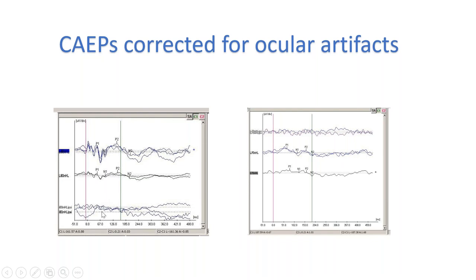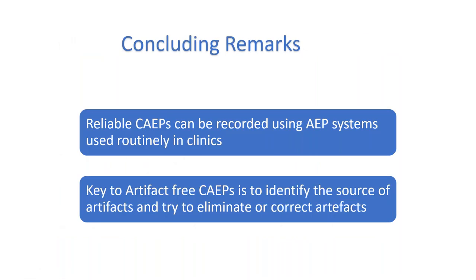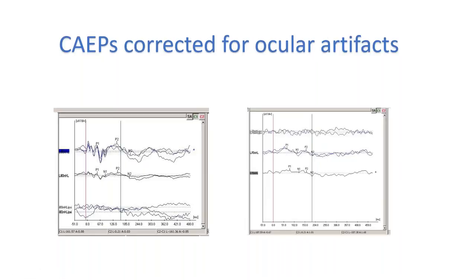And down below, what we have is all the ocular potentials recorded. So the subtracted waveforms actually have lesser amplitude than the original. And these are from two different subjects, and in both subjects we found similar results. Actually, there is also a study which shows that if you use artifact limiting, it gives better amplitude than correcting these artifacts, in a normal two-channel instrument I'm talking of. I'm not talking of a multi-channel equipment.